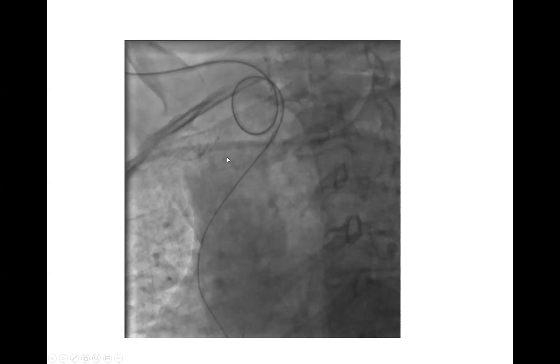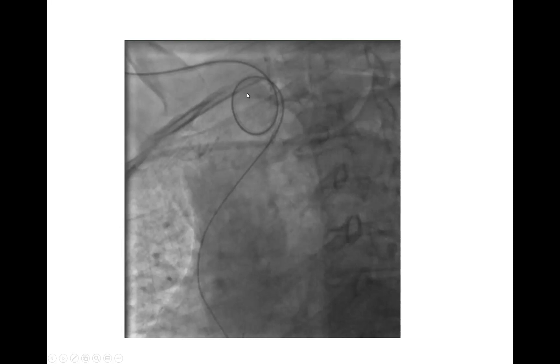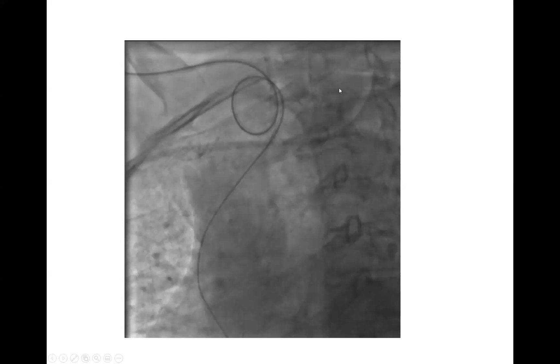How to maneuver through innominate tortuosity? You use deep breathing to elongate and straighten that curve, and you may need a glide wire — a slippery polymer-covered hydrophilic wire — to cross it. This is seen in up to 10% of patients from a right radial. Even when you get through, the catheter will be unstable and lose a lot of support — the moment you start pushing a stent or wire, the catheter will fly out. From a left radial it's less prevalent — probably 5% versus 10%. Or you can go to femoral if you're not getting enough support.